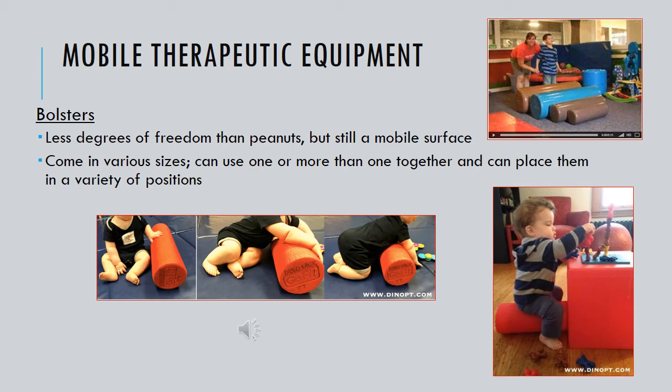Bolsters can be used in a variety of ways, some of which are shown in the pictures below. You could use a bolster for sitting. You could use a bolster for transitioning, perhaps from side sit to quadruped. You could use bolsters to help maintain positions while in quadruped.